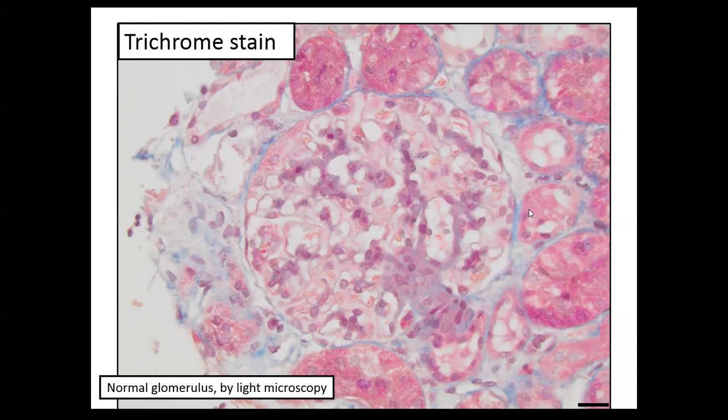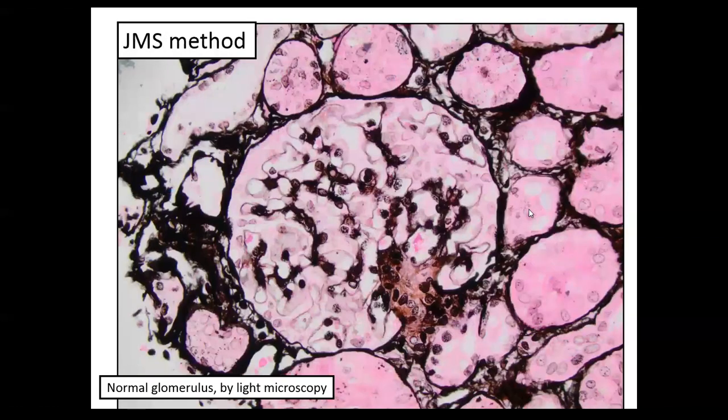I'm at a loss to say why this patient is proteinuric. I do the silver stain. Again, my capillary loops are right here. They have a very smooth, thin contour. I don't see any irregularities. I don't see any holes.